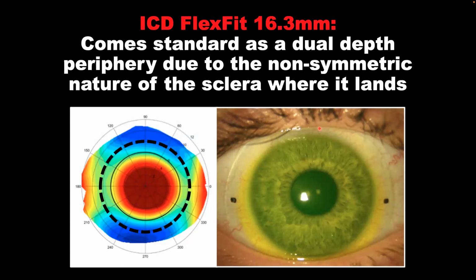They could go wherever they may settle, and actually that is okay because they will try to find the flat axis or the flat meridian of that sclera. So that is something to take into account. Just knowing that these hash marks are put in searching for that flat meridian of the sclera.